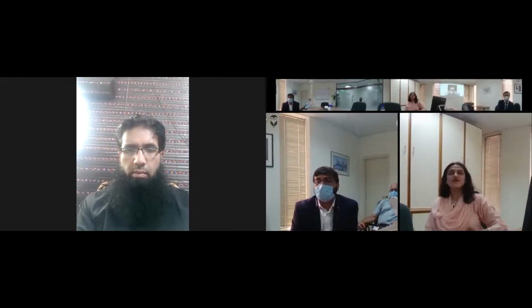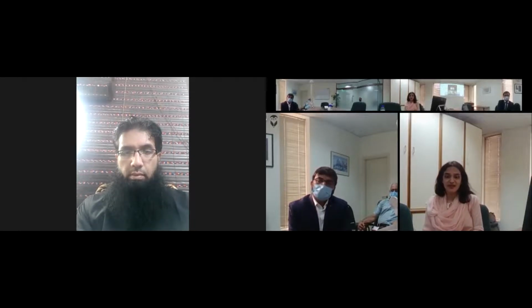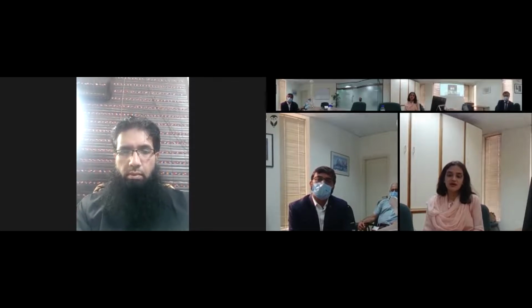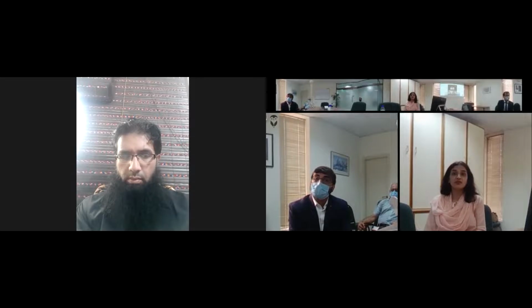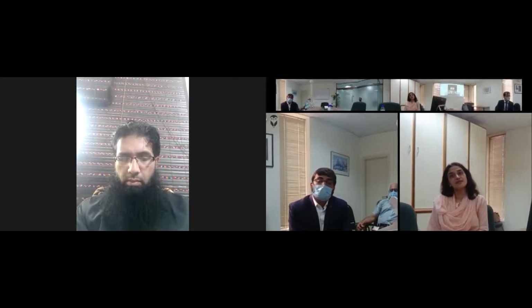Great. We will be looking forward to your results. Thank you. To see what would be good in our population. And when you see cancer patients for celiac plexus, how do you plan them? What is the best time? Because in a cancer hospital like Shaukat Khanum, you have very early access to these patients during their course of disease. So when do you feel is the best time to do a celiac plexus neurolysis?